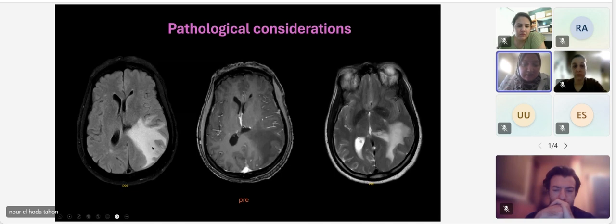This patient, we look here, and if we found something, is this a FLAIR, right? Is this edema? This is not a mass. Maybe it's a mass? No, it doesn't show enhancement. What about the T2? Here is the point. T2 is very hard here because you cannot differentiate the ventricles from the edema. But you can see it in FLAIR very well, and you can assess all the ventricular changes in FLAIR.